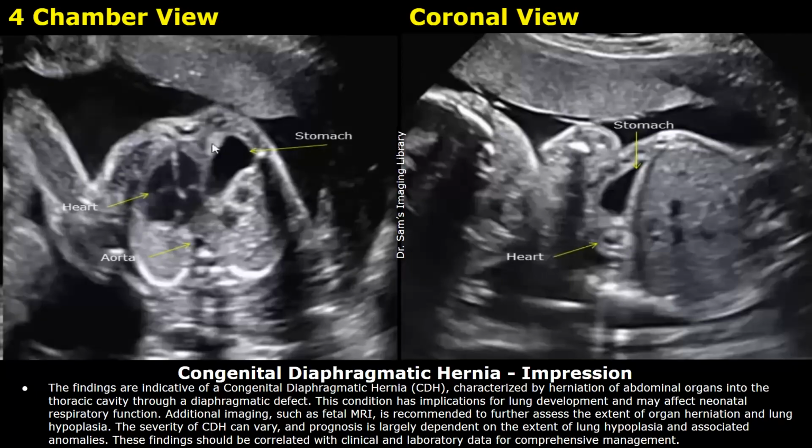The severity of CDH can vary, and prognosis is largely dependent on the extent of lung hypoplasia and associated anomalies. These findings should be correlated with clinical and laboratory data for comprehensive management.